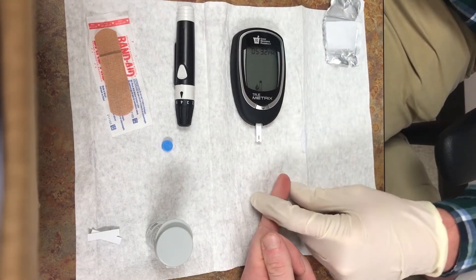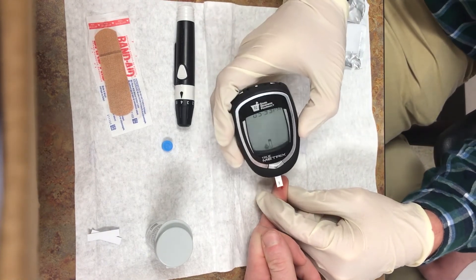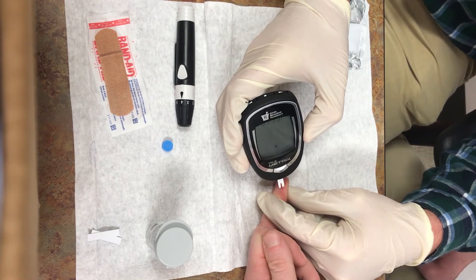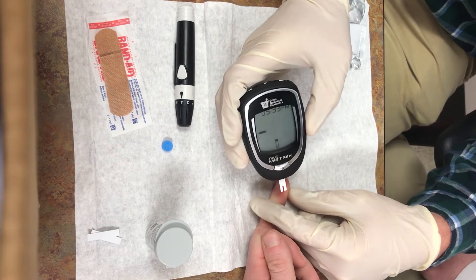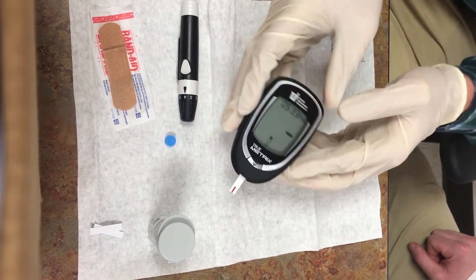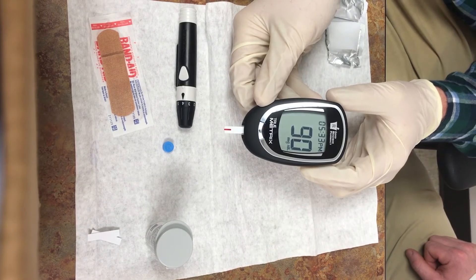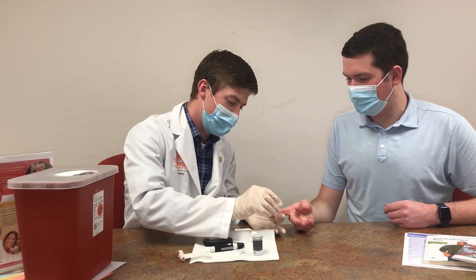Use a cotton ball to wipe away the first drop of blood from the finger, as this drop could contain residual alcohol. Gather blood from the finger onto the end of the test strip. While waiting for the reading to appear on the screen of the glucose meter, bandage the finger if necessary and dispose of the used lancet into the sharps container.